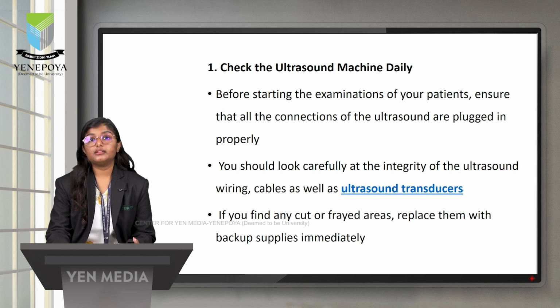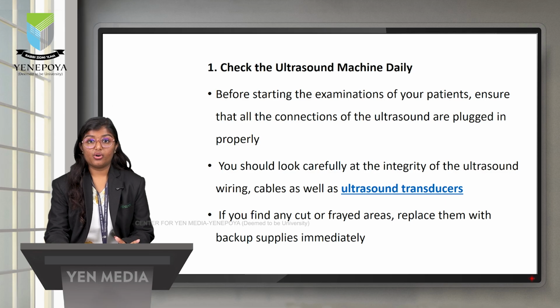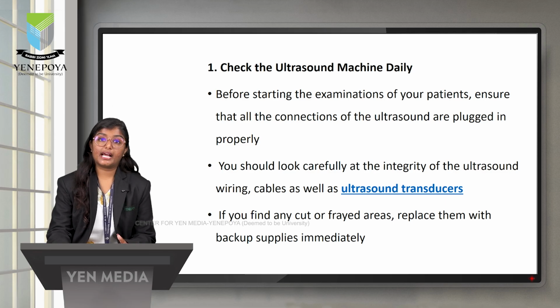Before starting the examination of the patient, ensure that all the connections of the ultrasound are plugged in properly. We have to look carefully at the integrity of the ultrasound wiring cables as well as ultrasound transducers. If you find any cut or frayed area, replace them with backup supplies immediately.